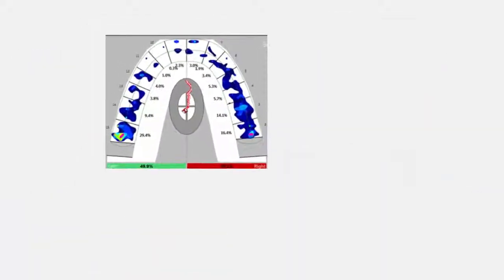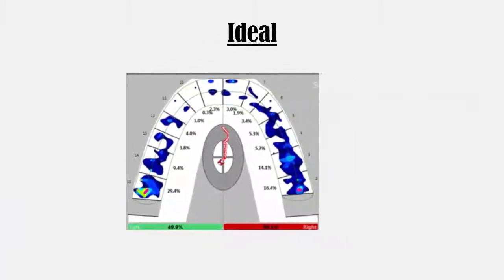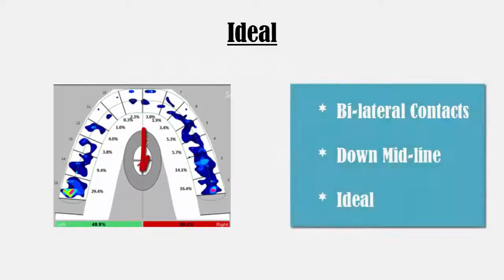The first example shows an ideal center of force which starts in the center and moves down the midline of the arch. This pattern illustrates early anterior contact followed by equal bilateral posterior contacts.